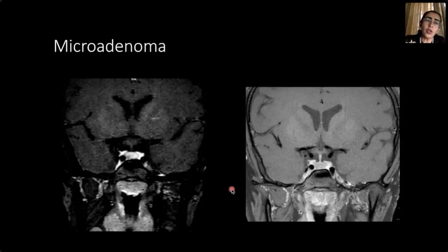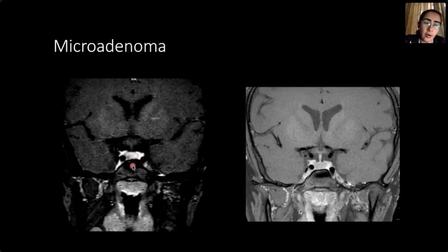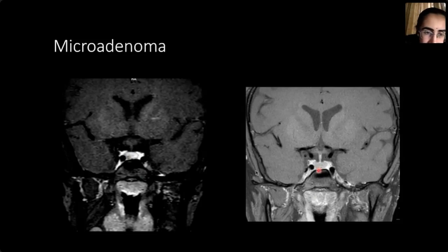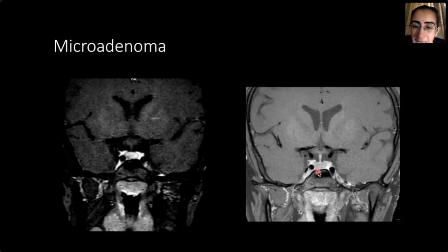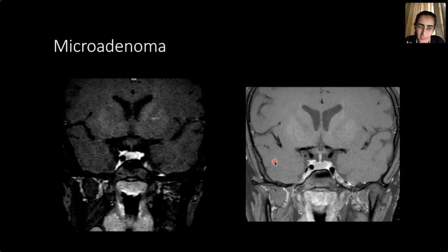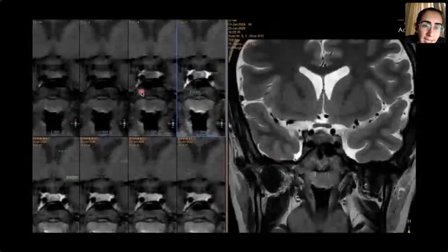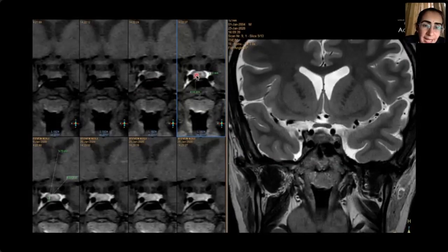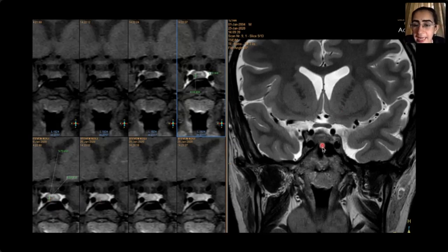The resolution of the dynamic sequence is good, but the signal-to-noise ratio may be lower. It is very useful for detecting small microadenomas missed on routine post-contrast sequences. On the dynamic sequence we can see differential enhancement; without it, the lesion would be easily missed. On routine T1 coronal images the SNR is much better. Thin 2–3 mm sequences are required for pituitary evaluation. The same microadenoma is shown measuring approximately 4 mm in diameter, barely visible on T2-weighted images.